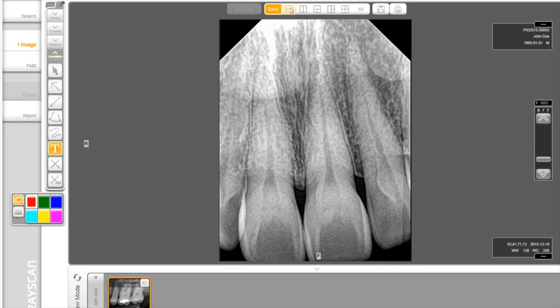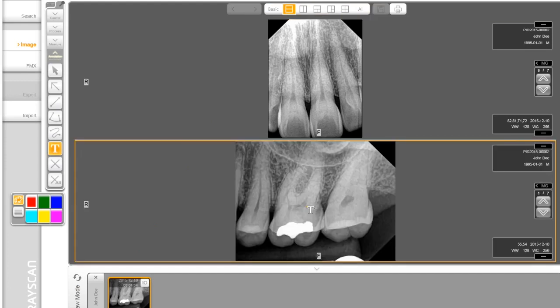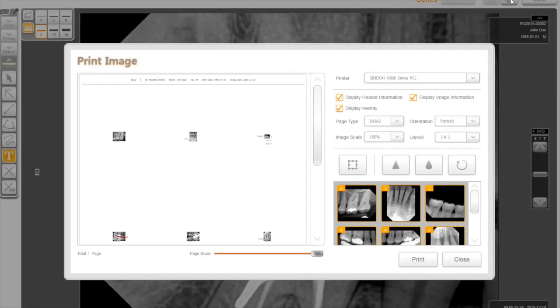The Compare Images function allows a user to view up to 5 images in a side-by-side comparison window. This tool allows drag and drop function. If you decide to save the adjustments, click on Save. Also, you can print out by going to Report.